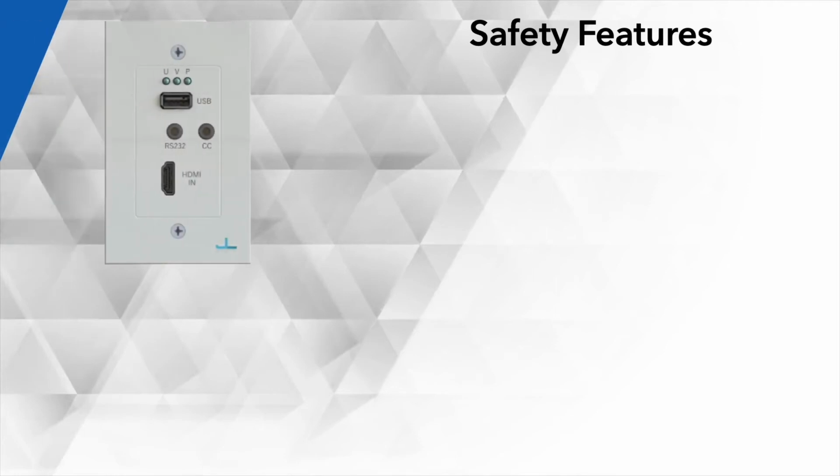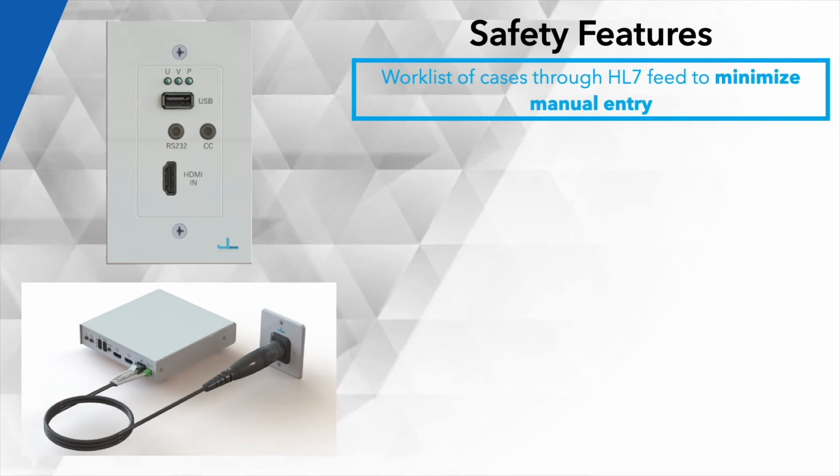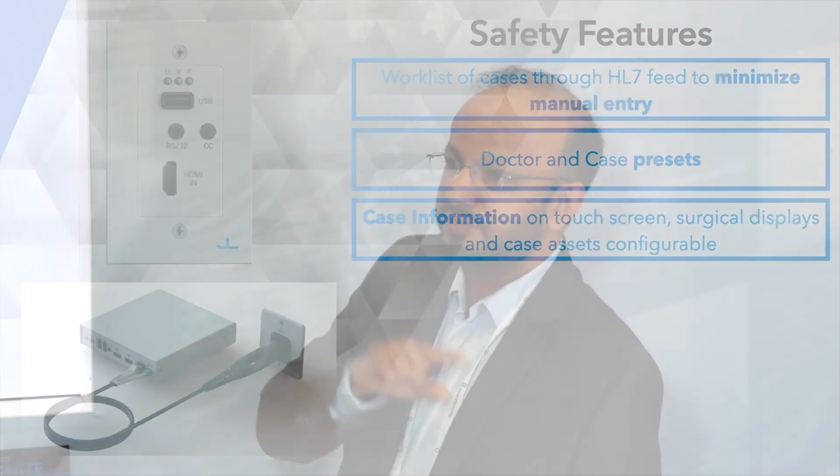So that's one application. And being able to detect which sources. If you have 500 sources, for the nurse to find it, when the surgeon says, hey, route that C-arm to this display, he's not going to say source number 8 or so. So it's important to only bring in those icons that are important during a surgery.